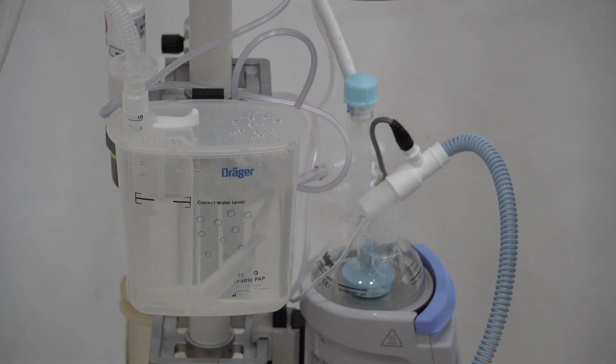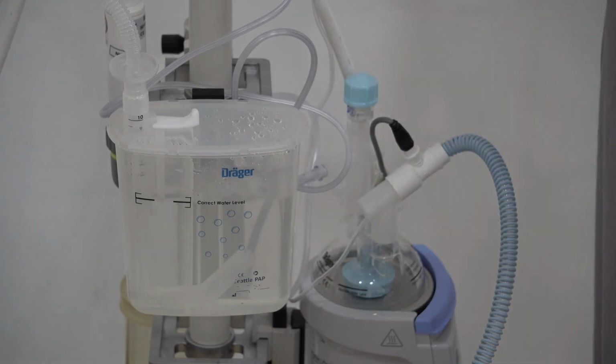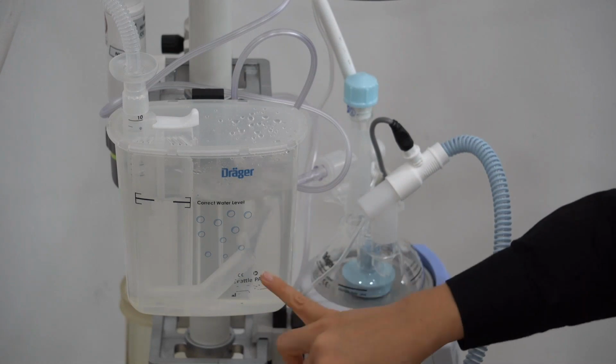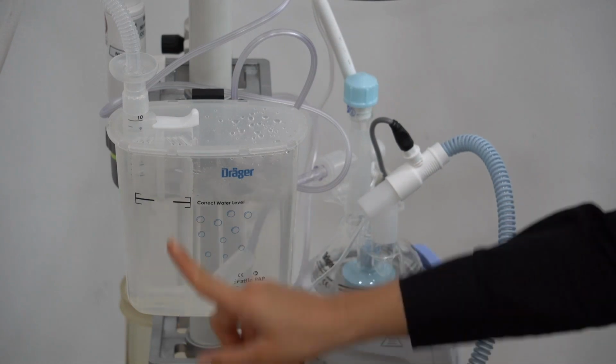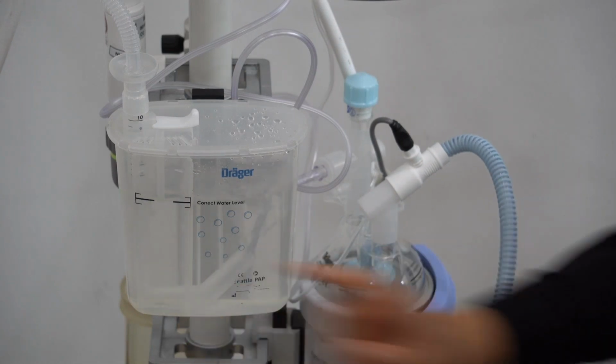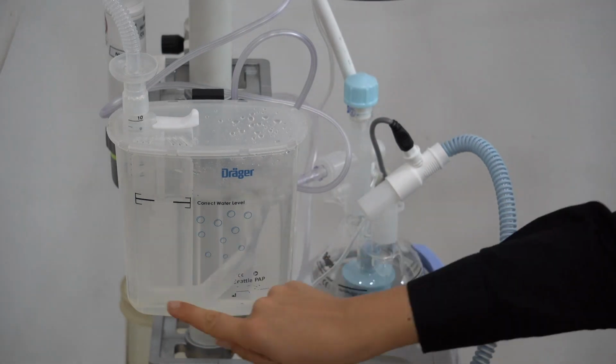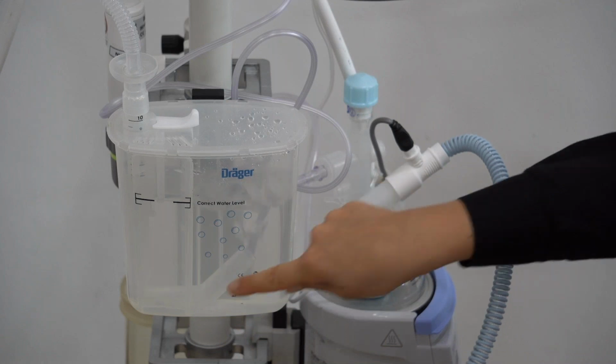And I think Linda has also mentioned in her lecture that in the normal bubble system, usually you have just a 90-degree tube that generates these bubbles. In the Seattle PAP, you have a 135-degree angle.